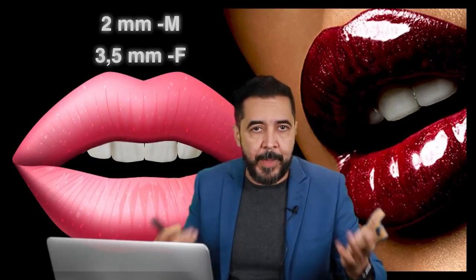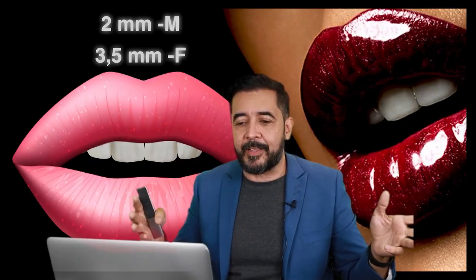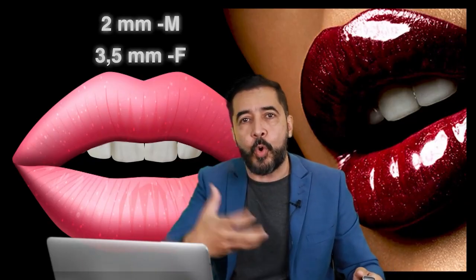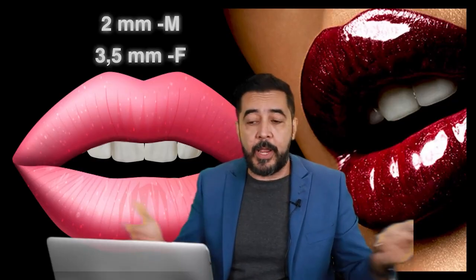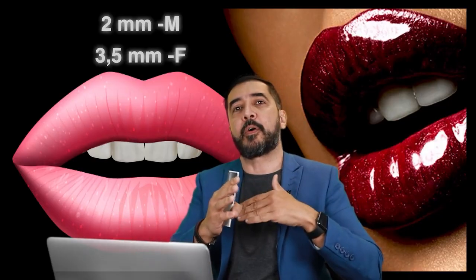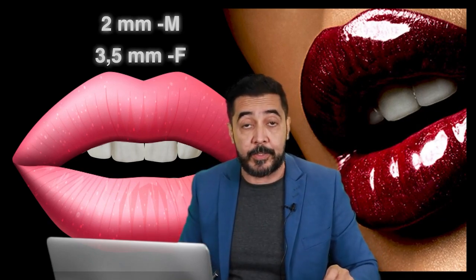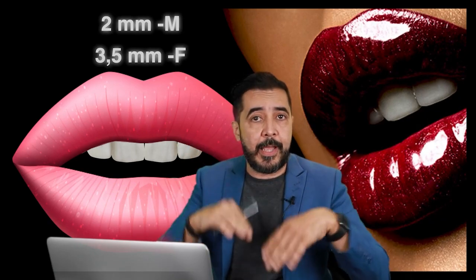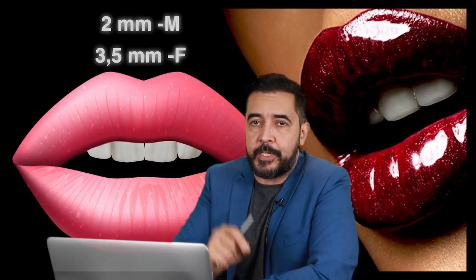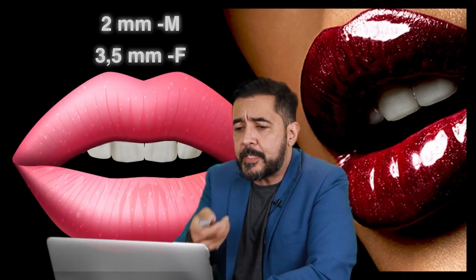We know that people don't want to have this appearance of aging. Of course, we have to respect that. I'll show you that each age has its charms, but we know that people want to show less age than they really are. But for that, we can work with our treatment plan, doing the proper positioning of our brackets. We can show more or less incisor tips, doing the right positioning right in the beginning of the orthodontic treatment. So this is something very important.